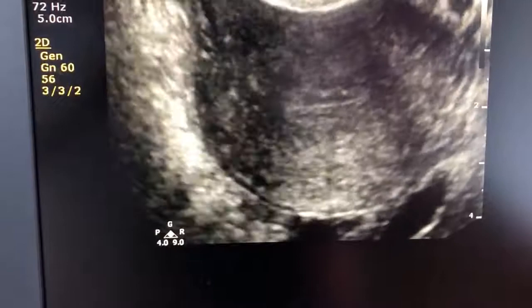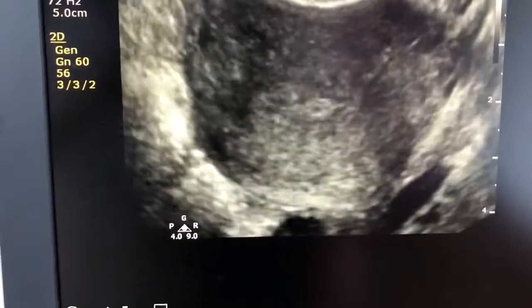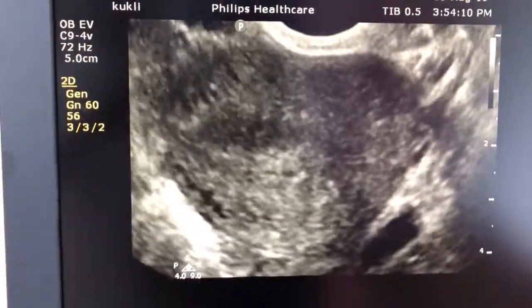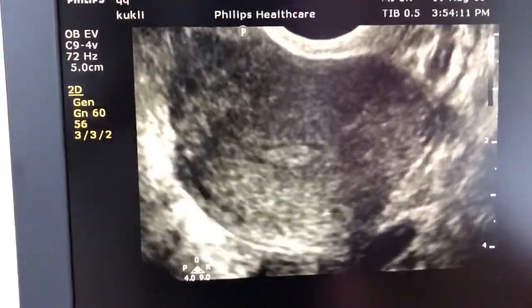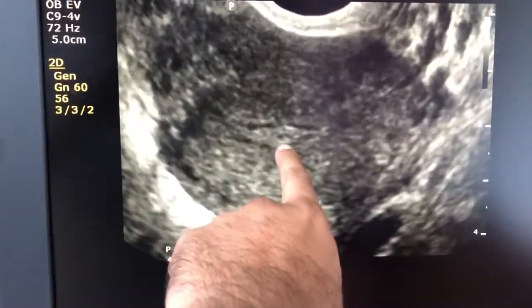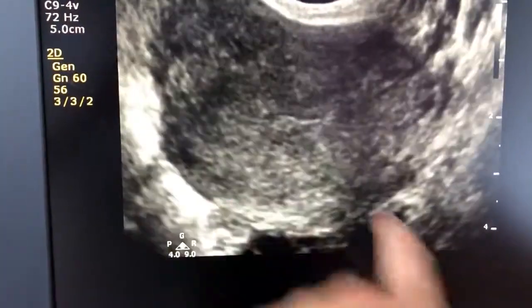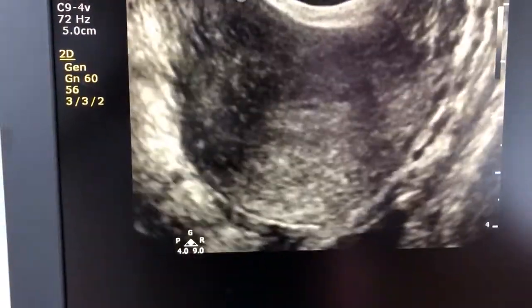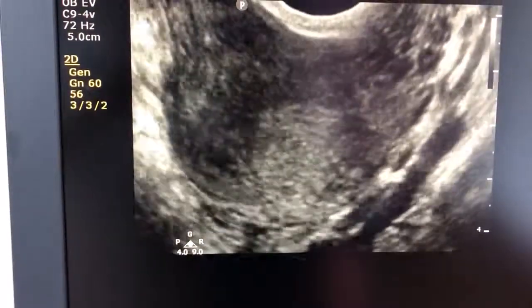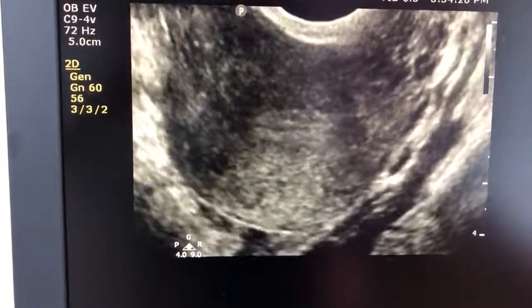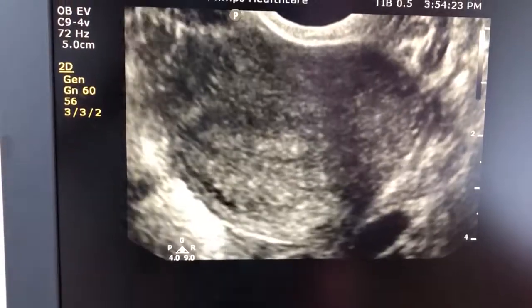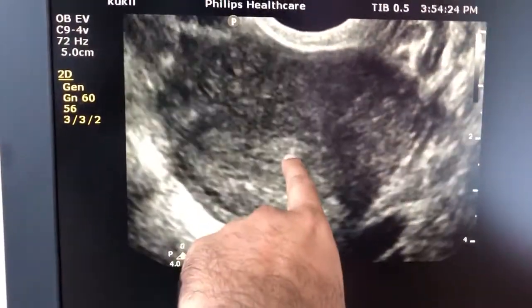We will see this in the transverse view. In the transverse view, here is the polyp. Now going towards the lower side of the endometrial cavity, there is no polyp. Again at the fundal side, this is the polyp.